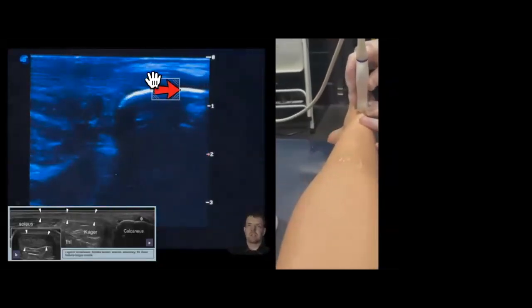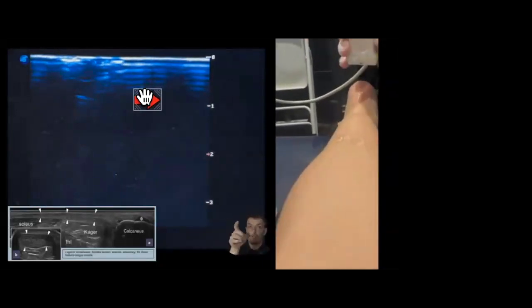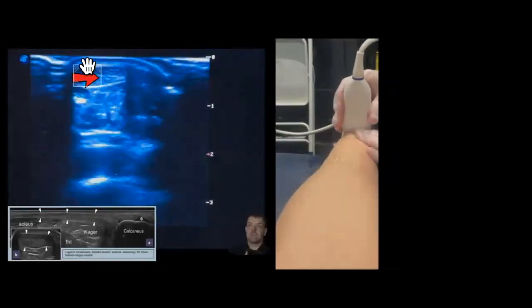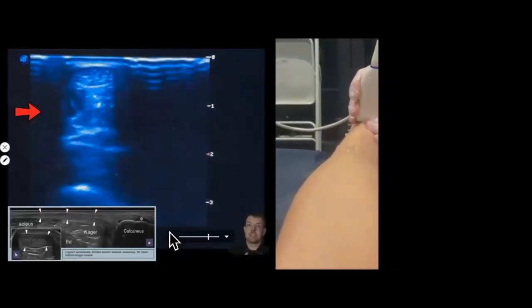Okay, so there, yeah, there's your Achilles, there's your calc. And then now we're going to switch the view. So now we've got a short view, and then there's the Achilles end on. Yeah, so that's what it looks like just there. So this is the cable. You've got that fiber optic cable with all those wires in. Cut the end, having a look at it from the end on, and you can see all of the fibers. Those are the tendon fibers basically, and you can see them all there.